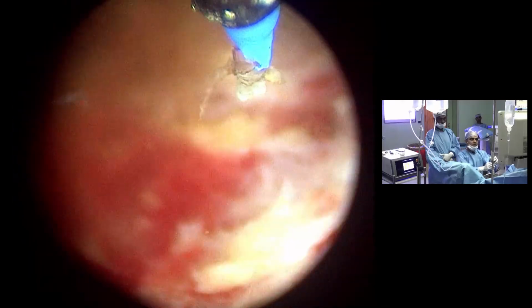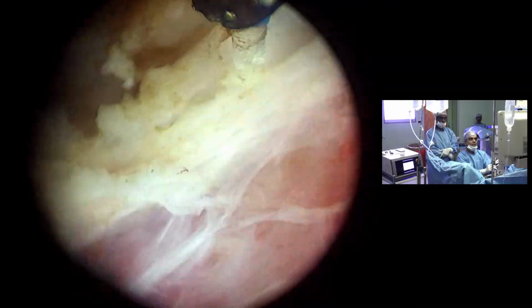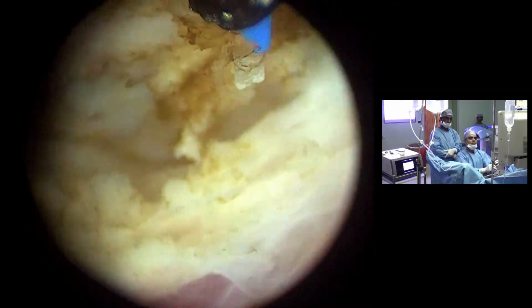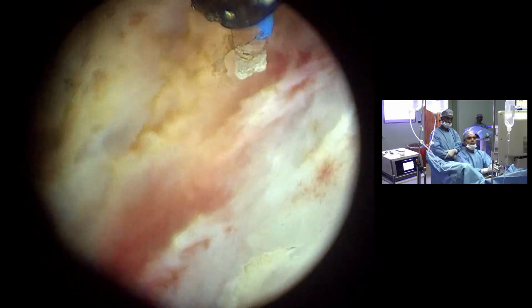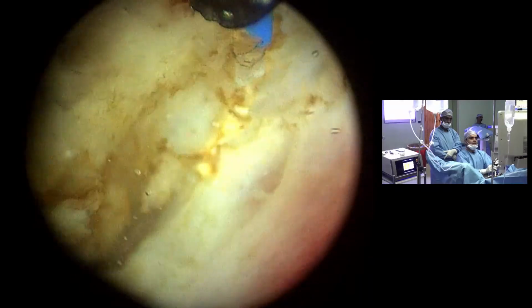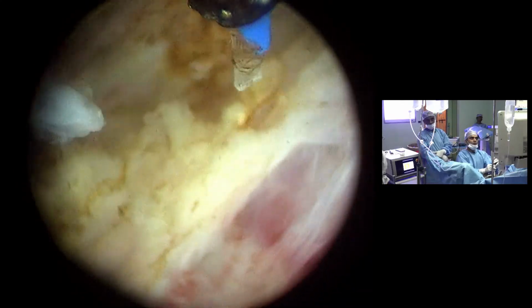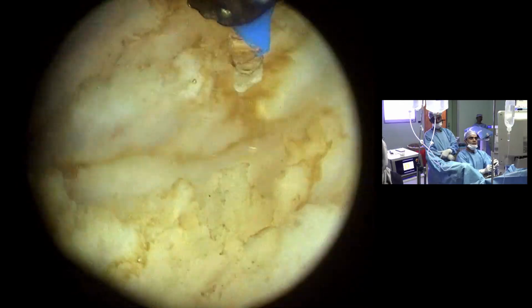So this is the entire floor, and so these are the capsules, and somewhat oozing gland.